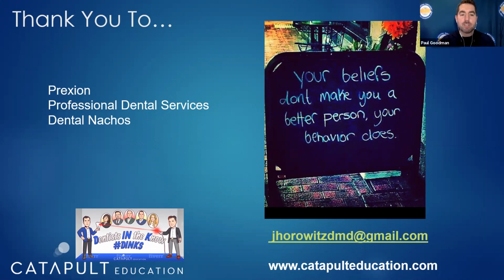So we had some great people on Zoom, great people on Facebook. One question was, how do you handle edentulous patients who cannot tolerate appliances in their mouth? I know exactly where they're going. So can you make an oral appliance in an edentulous arch? The answer is yes for the maxillary arch with the suction that some of the manufacturers are able to get. Somnomed makes a great appliance. They understand denture fabrication and have been in the market for a while. So when I have a maxillary edentulous arch, I will typically go with a Somnomed appliance. For the lower arch, you do have to draw a line in the sand. You need some type of retention, which is either going to be 4 mini implants or 2 conventionals with locators.